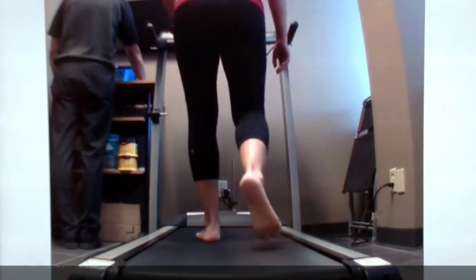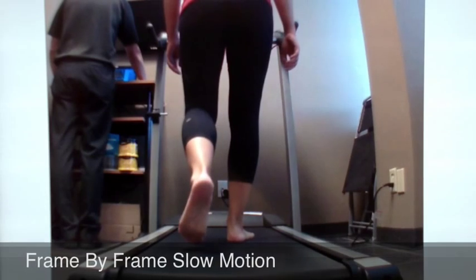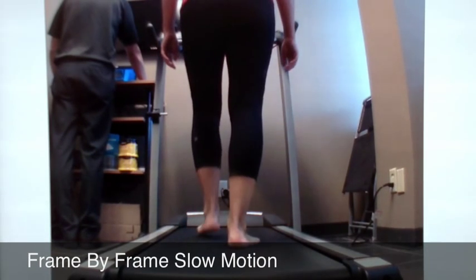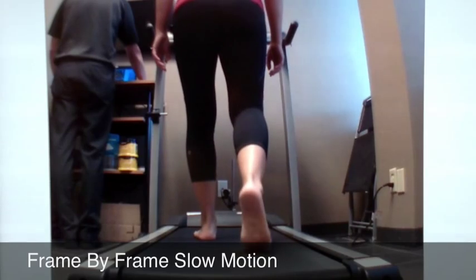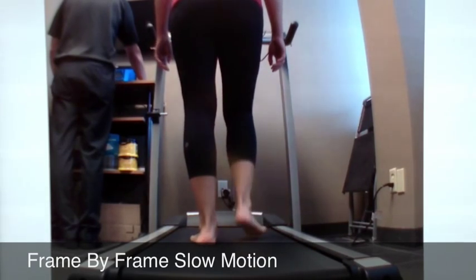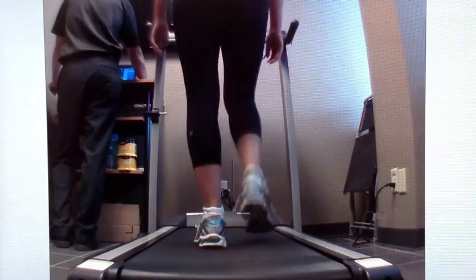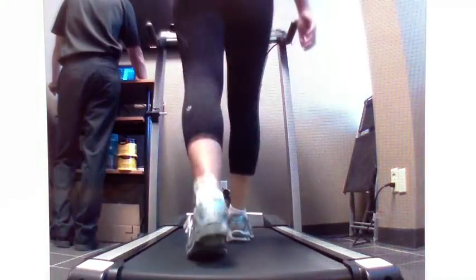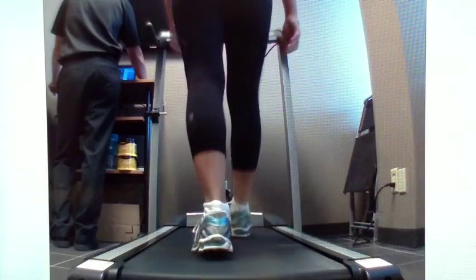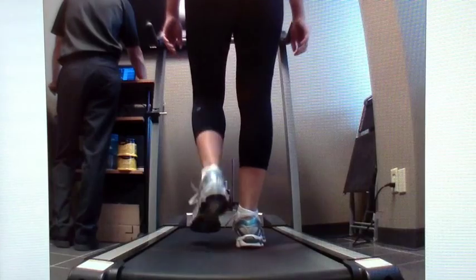We also have the ability to view the video in slow motion, or for even better detail, frame by frame slow motion. If we have concerns about the type of footwear you wear, or how you perform in your shoes when walking or running, we can record you in your athletic shoes and again slow it down to slow motion to see how the footwear performs.